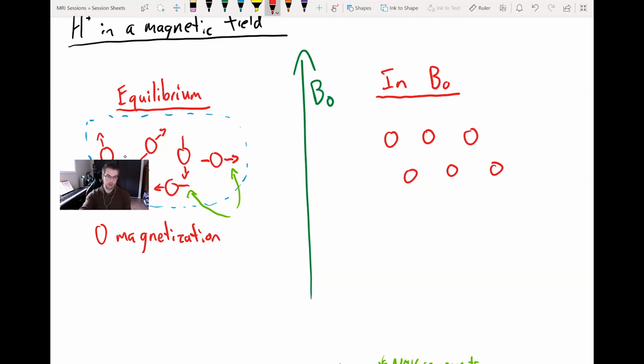And now their orientations tend to be either angled upwards or they can be angled downwards. I'm going to make this one drawn similar that way. They can also be oriented downwards. So still primarily vertical orientation for these magnetic fields, but they can be up or down.